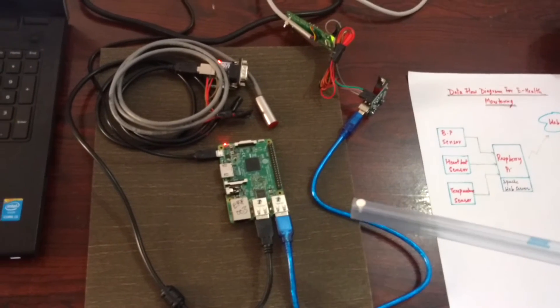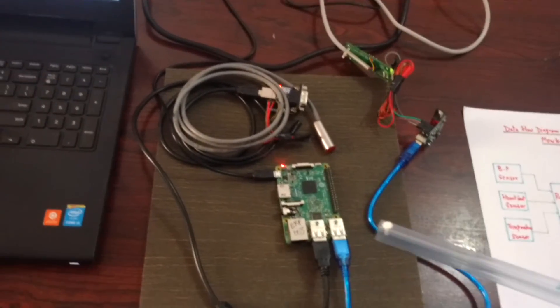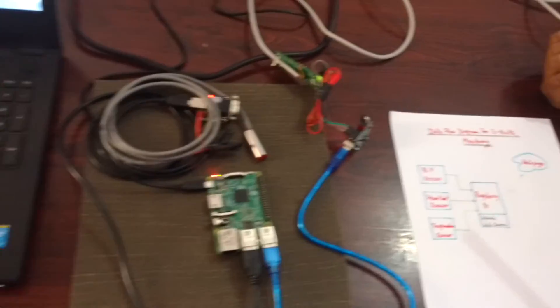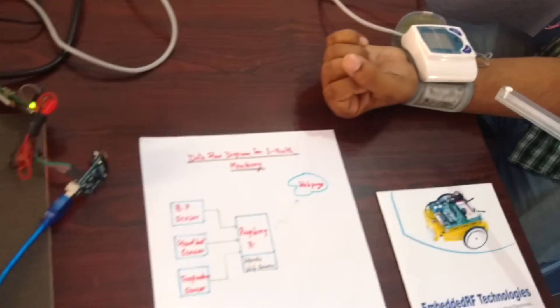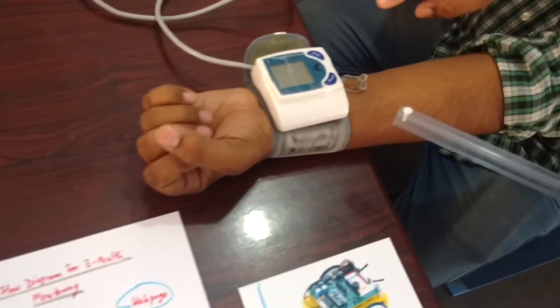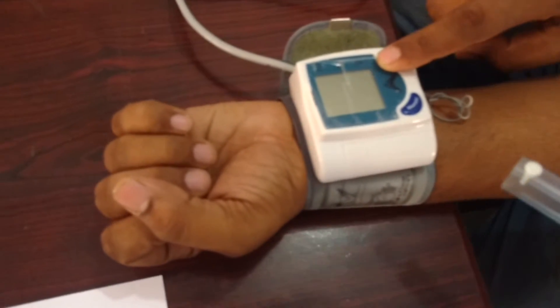Now we will be showing the demonstration of the project. We are switching on the BP sensor which is connected to a patient.